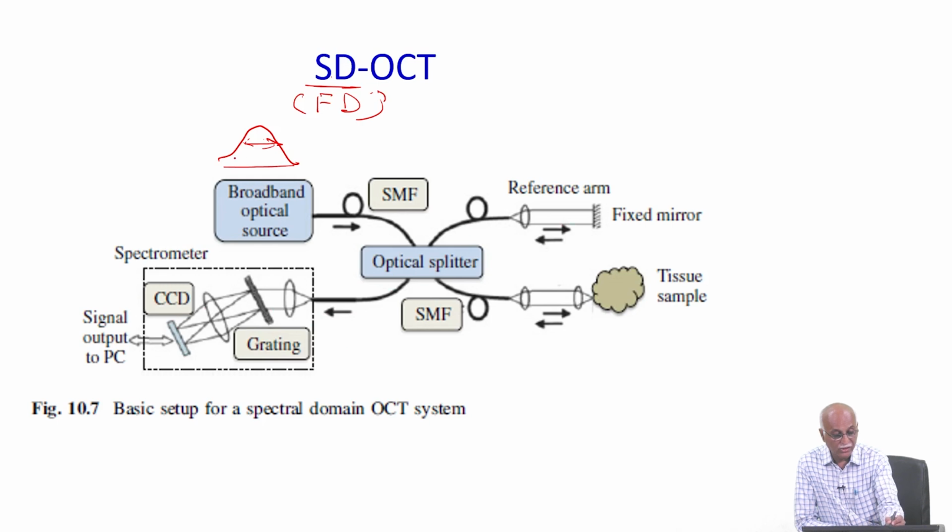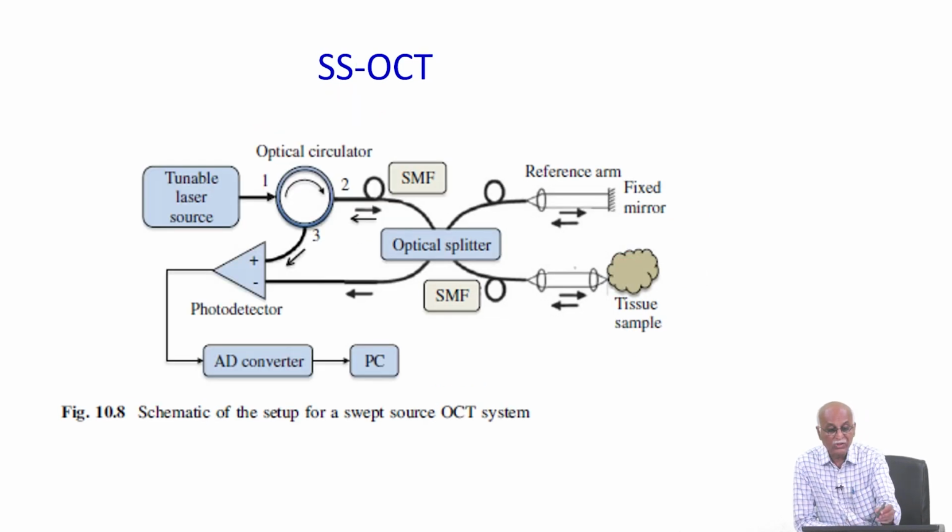So, basically in frequency domain OCT, if we have lambda 1, lambda 2, different wavelengths, multiple wavelengths, then corresponding to each of these wavelengths there will be some signal, an integrated signal, correct, from different layers, etc. Subsequently, the inverse Fourier transform of this will provide us the depth information of these different layers, Z1, Z2, Z3. Of course, it will be an optical path length, not the physical depth difference, but the optical path difference will be provided.